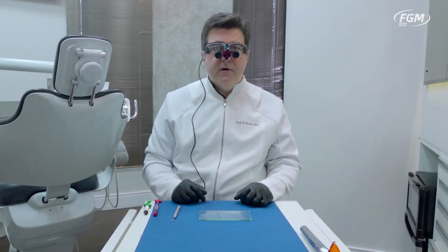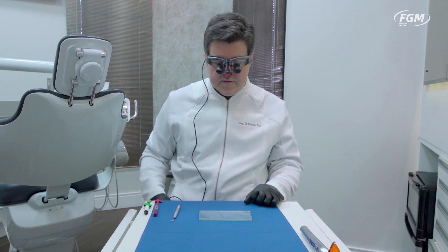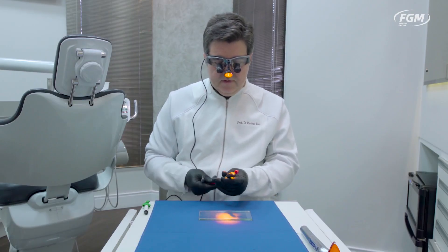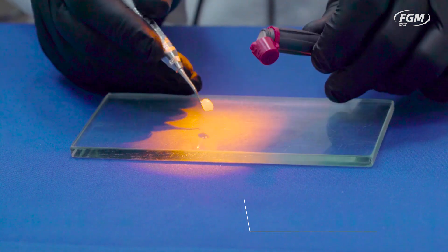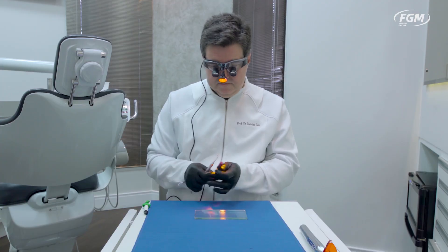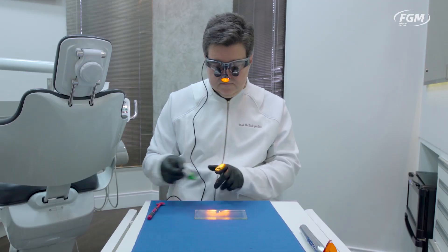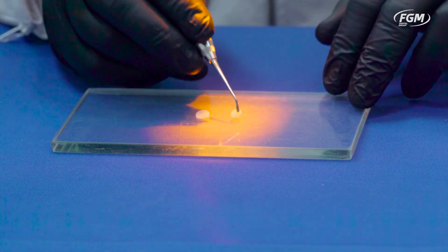Now we're going to test the effect of a well-illuminated operatory light on bulk fill restoratives — one worldwide well-known bulk fill restorative and the other one, OPUS Bulk Fill with the proprietary APS technology. I'm going to turn on my loop light with the amber filter, and I'm going to try to dispense an equal amount of composite for this demo, as close as possible.